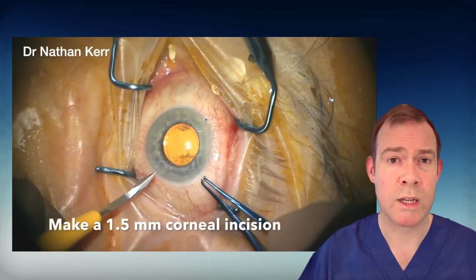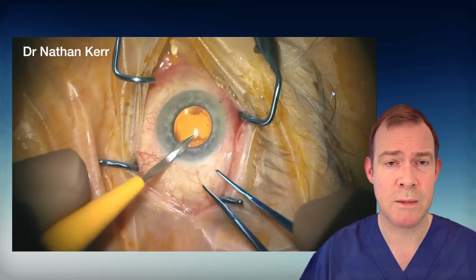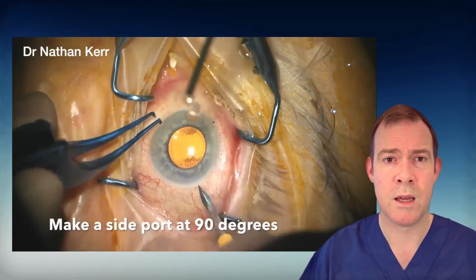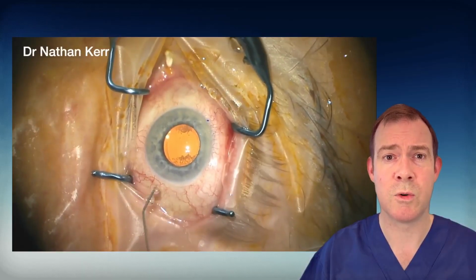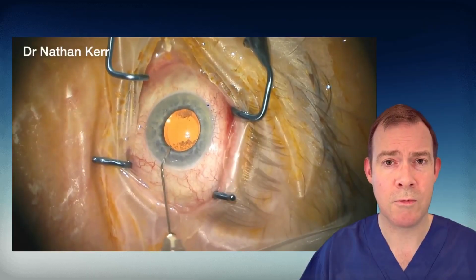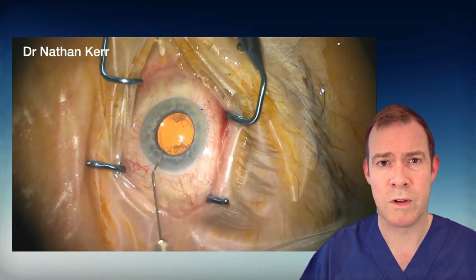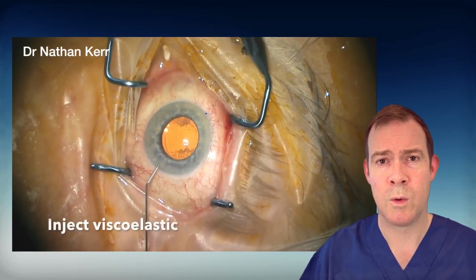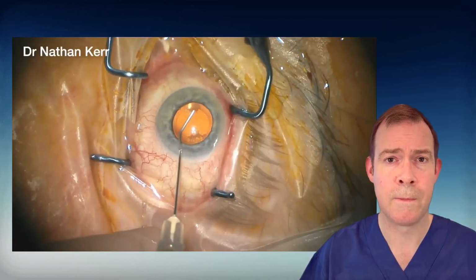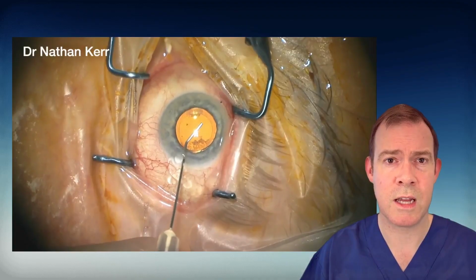We now make our corneal incisions, which are approximately 1.5 millimeters in diameter, between 3 and 5 o'clock, making one to insert the XEN and a second for side port access. Acetylcholine can be helpful in phakic patients, but is not mandatory in pseudophakic patients. We now want to inject a cohesive viscoelastic. Some common brands include Provisc or Healon GV for this step.